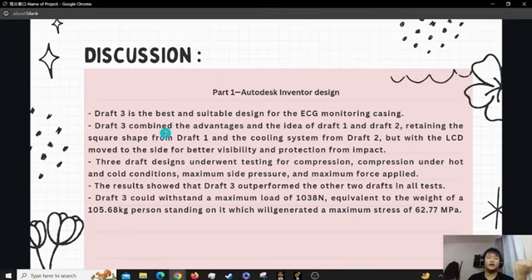Draft 3 combines the advantages from draft 1 and draft 2. It retains the square shape from draft 1 and also introduces the cooling system from draft 2. However, the location of the LCD is different from draft 1 and draft 2. The LCD is located at the front, which is more convenient for users and also provides extra protection.